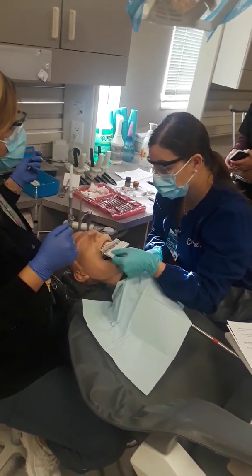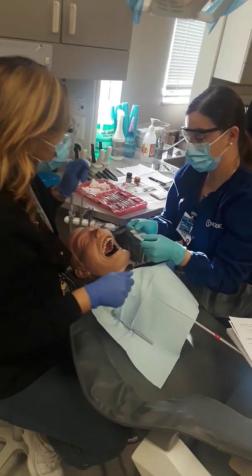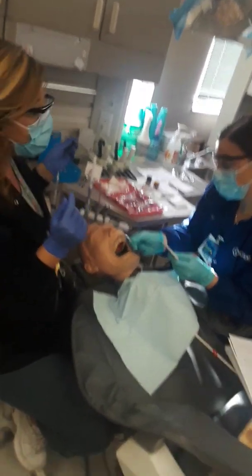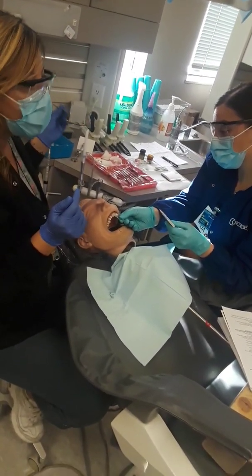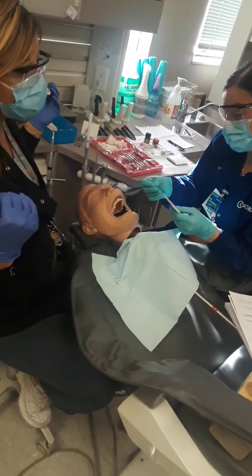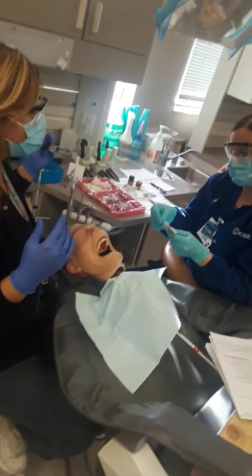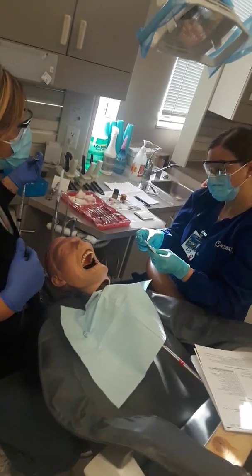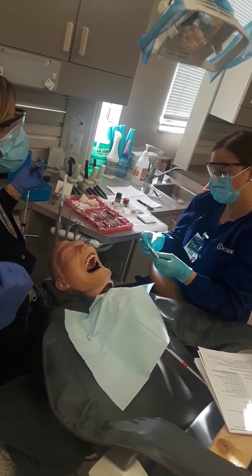I'm going to stop you real quick because I was always taught, yeah. You guys out? Yeah. Okay. So always take the shade guide out. Most people are about a shade A2. This is kind of the universal shade everybody is. So if you're lighter than that, you can go to a number 1. Or if you're darker than that, you can go to a number 3.